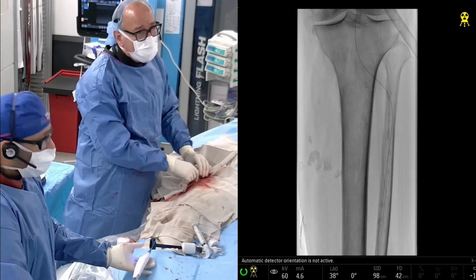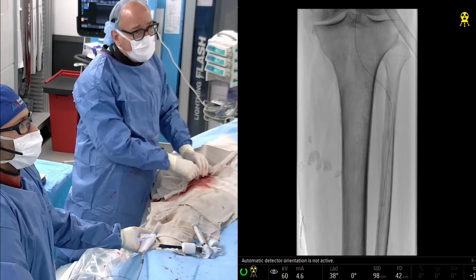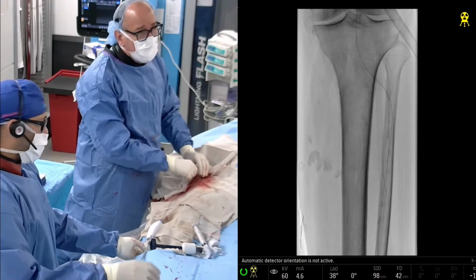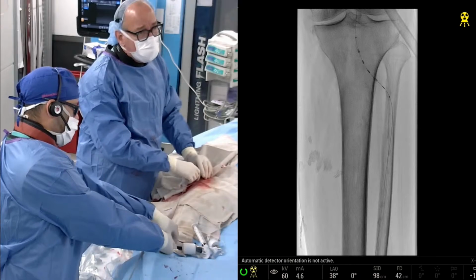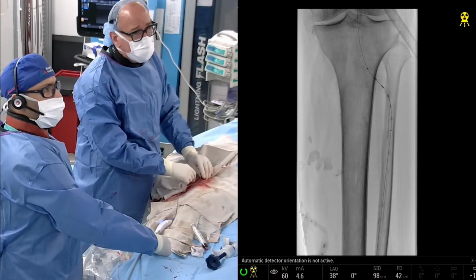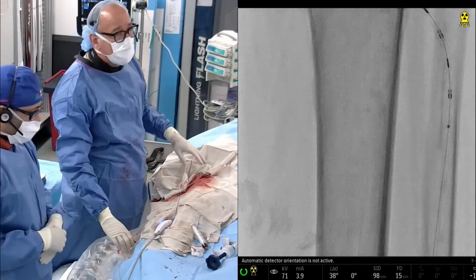And you'll see there's some very conspicuous radiopaque markers that we're going to notice in just a few moments as we get this up. This tracked obviously very, very well. So I'm going to mag up because I think this is worth reviewing.